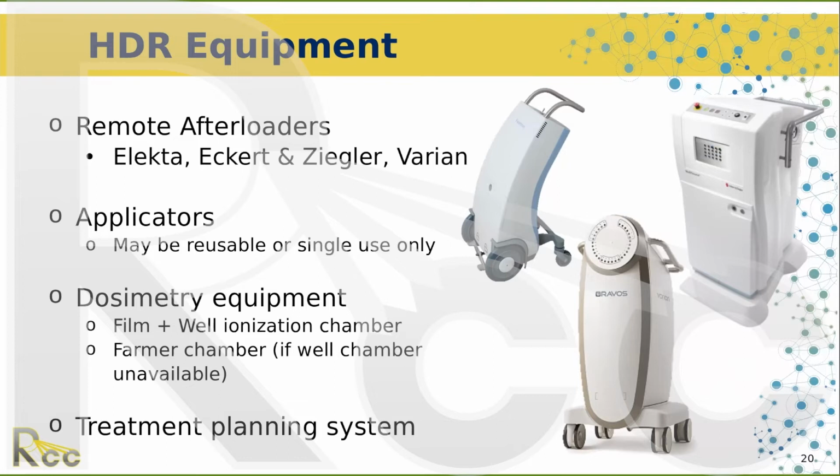It's interesting. We just turned our afterloader room into a CT simulator room. So our treatment room that's well shielded for cobalt is going to be able to hold a CT, but you may have to add conduits and power for it. I'm sorry, but I can get back to you on a room size. Okay, thanks. Good question, Moses.